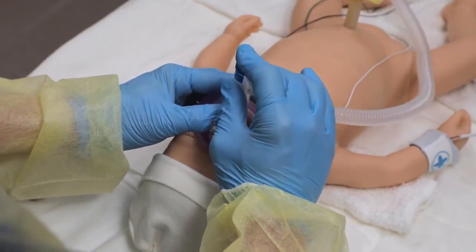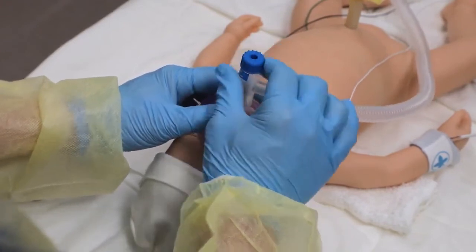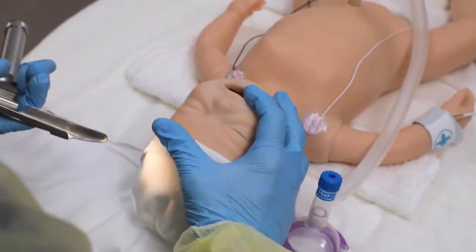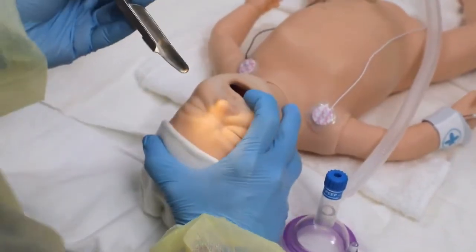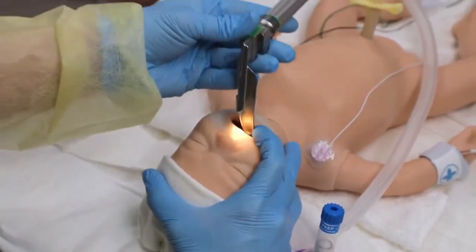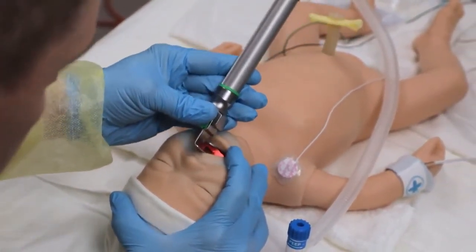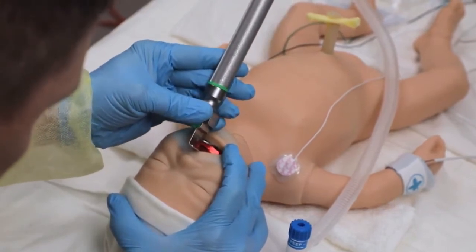Adjust the height of the warmer or bend down to improve your view of the airway. Use your right index finger to gently open the baby's mouth. Hold the laryngoscope in your left hand. Insert the laryngoscope blade into the right side and slide the blade over the tongue toward the midline.